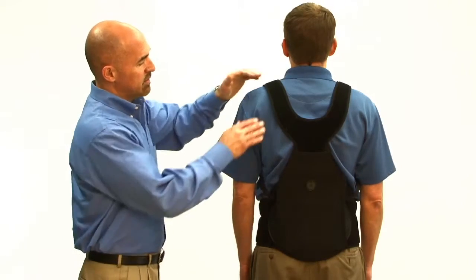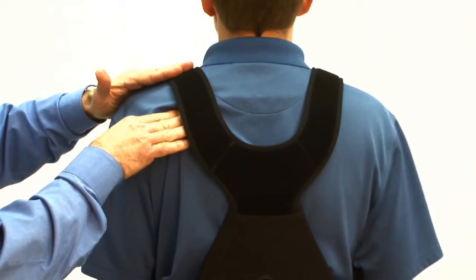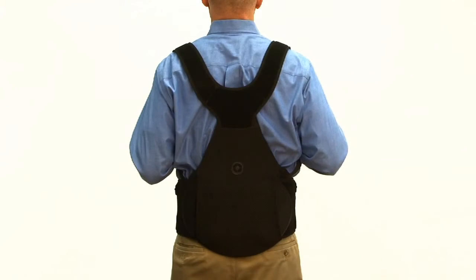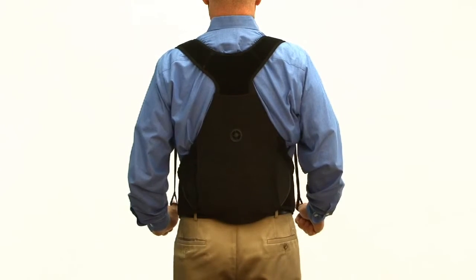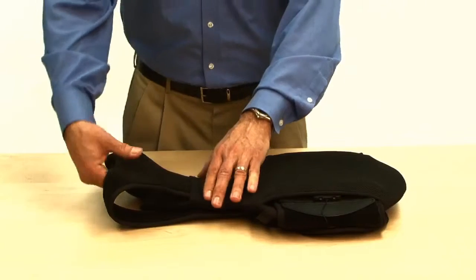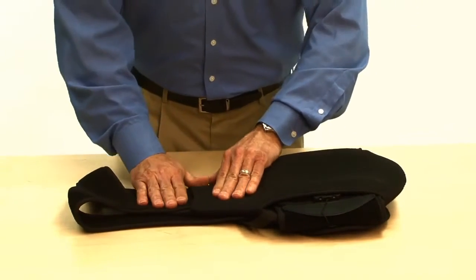Sleek Flex tips and tricks. To locate the scapular spine, palpate at the mid-shoulder level. Be sure to tighten the ComfoGuide pull tabs before the shoulder straps — otherwise the brace will migrate upwards. After adjusting the Thoracare support, be sure it's securely fastened. The Thoracare support system promotes good posture and provides a kinesthetic reminder for patients to use their back extensor muscles.